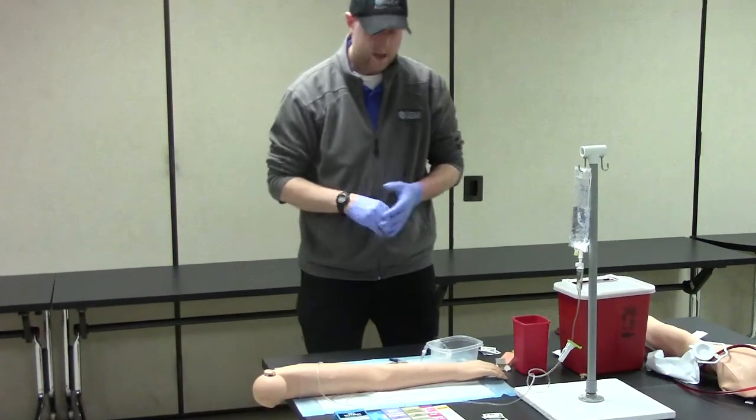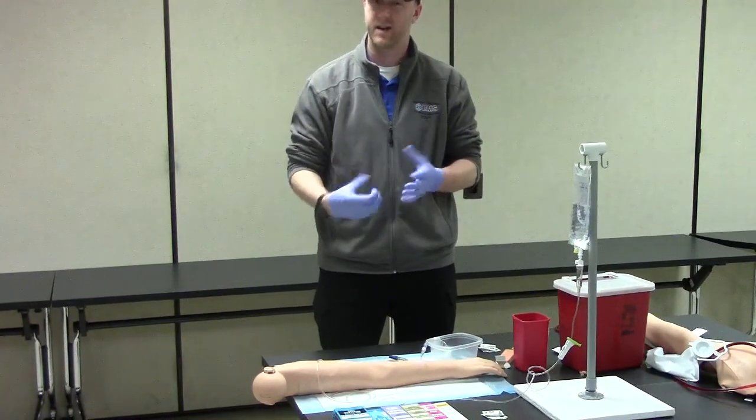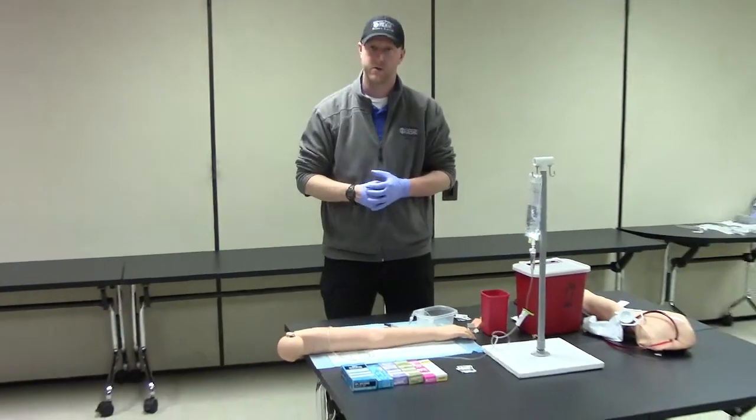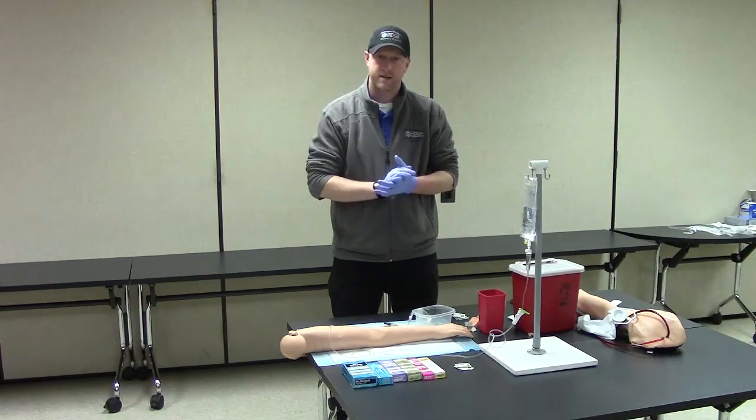And then watch the patient, make sure they don't have any adverse reactions to the medication. Once again, make sure the medication is doing what you actually want it to. Alright, if you have any questions, you'll get a chance to ask in class.